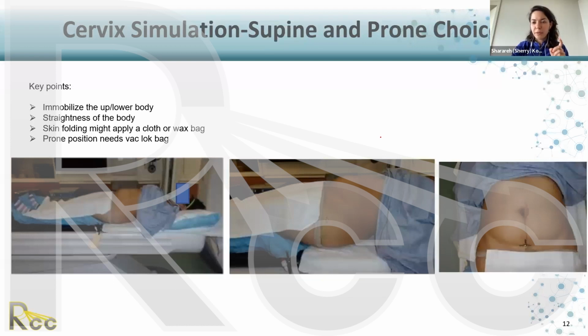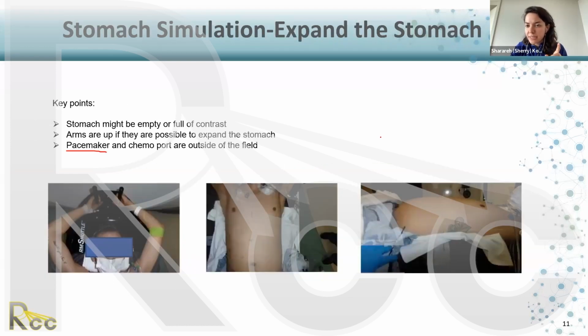Before we get too far from it, do you mind explaining the ruler technique that you were mentioning earlier? Yeah, so make a vertical ruler and fix it on the table. Make a sliding ruler, maybe with a little screw, so that you can slide and immobilize it.